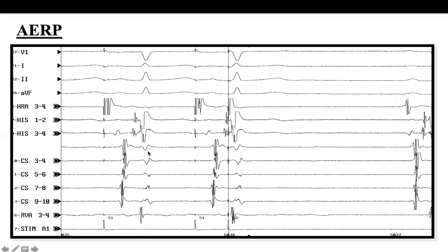Good, which means there is no accessory pathway. Yes, the ECG is showing that there is no accessory pathway, and probably the HV, although we don't have the exact measures, doesn't look like there is a delta wave, and the HV looks to be normal. The second one is pacing the right atrium. Yes. Then HV. Yep.